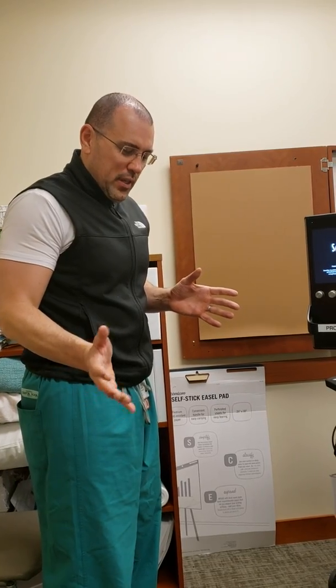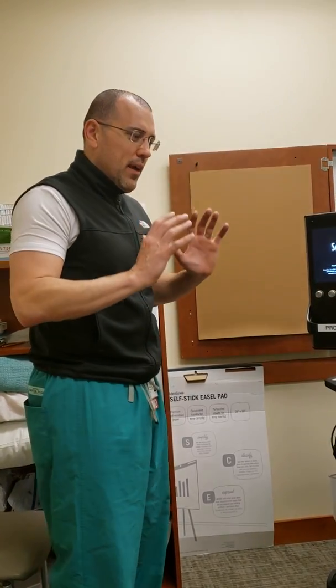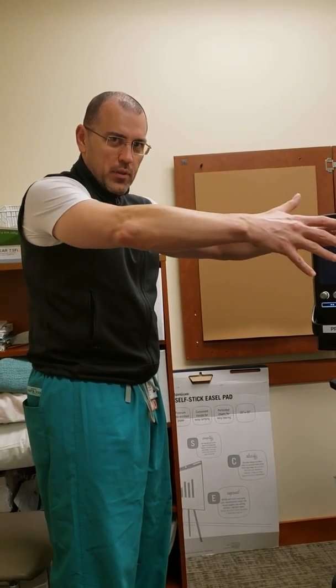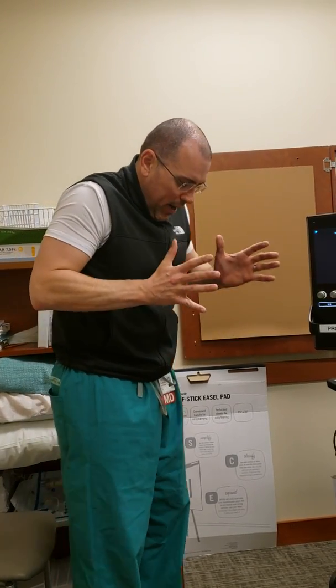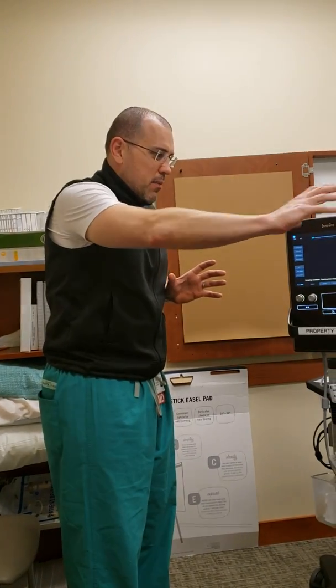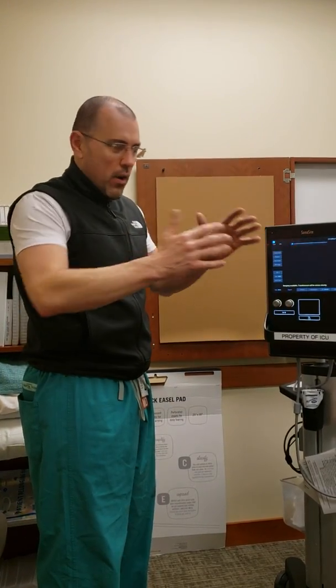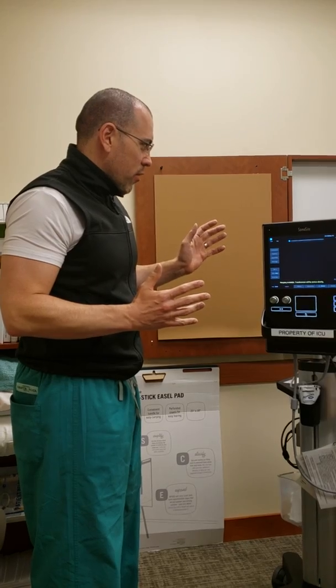An important thing when we do our procedures: it's common for some reason to put the ultrasound right next to us — say if I'm on the right side of the patient. But what we always want is the ultrasound machine across from us, so that wherever we're working we can look across and see the image without having to look behind us. Always have the ultrasound on the other side from where you are.